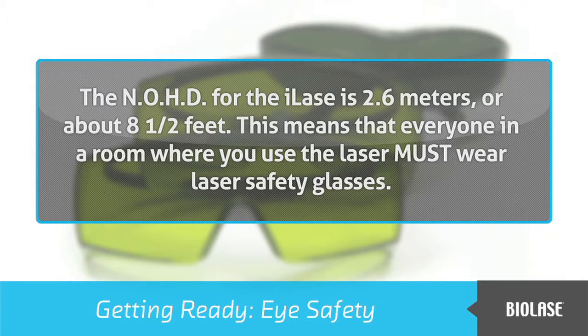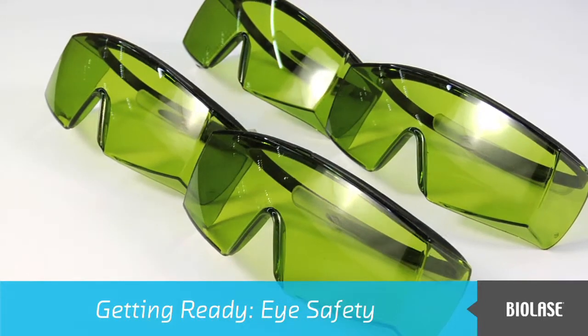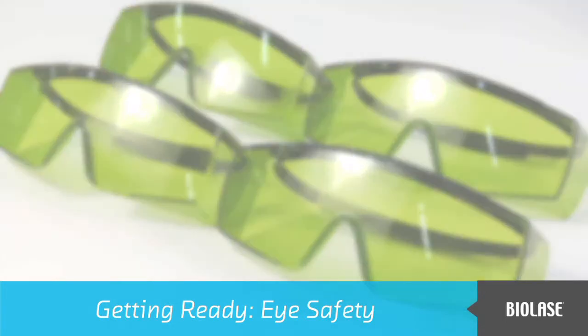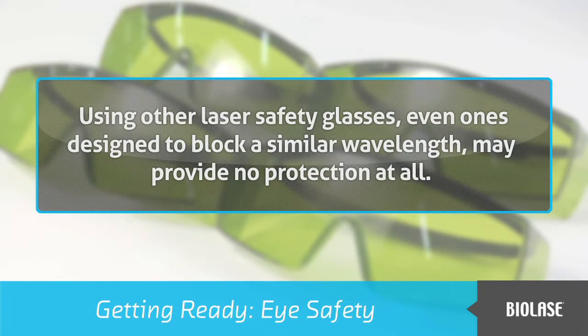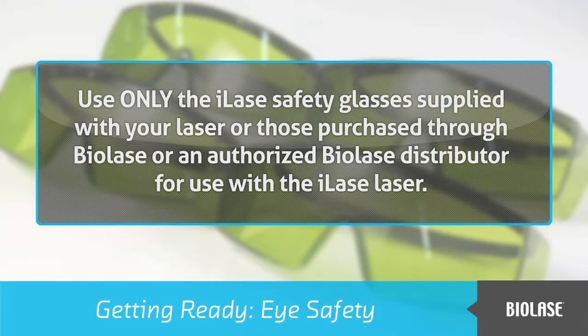This means that everyone in a room where you use the laser must wear laser safety glasses. The iLase system comes with laser safety glasses especially designed to protect eyes from the particular wavelength of the iLase laser. Using other laser safety glasses, even ones designed to block a similar wavelength, may provide no protection at all. Use only the iLase safety glasses supplied with your laser or those purchased through Biolase or an authorized Biolase distributor for use with the iLase laser.